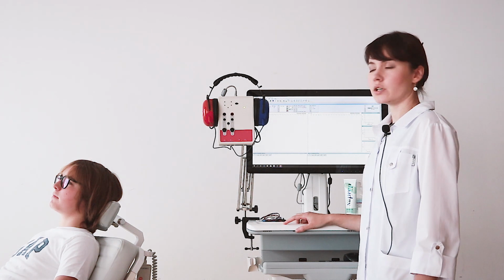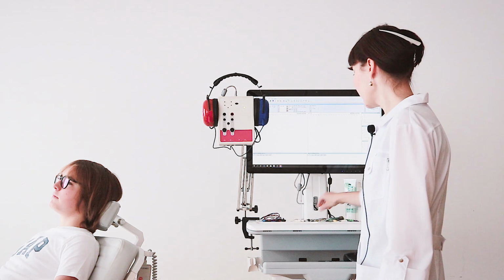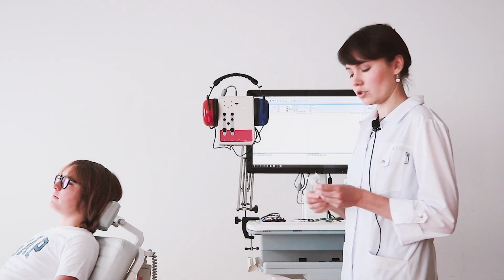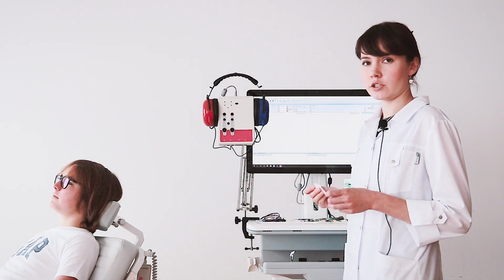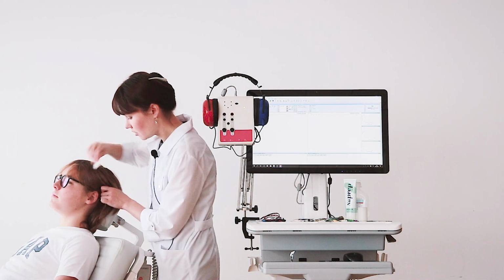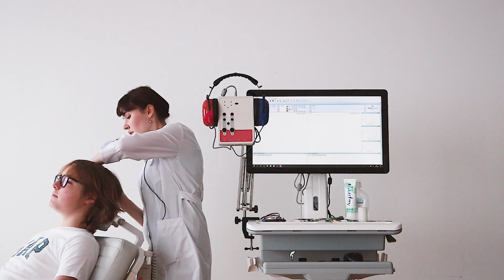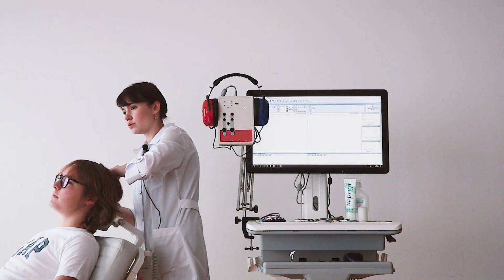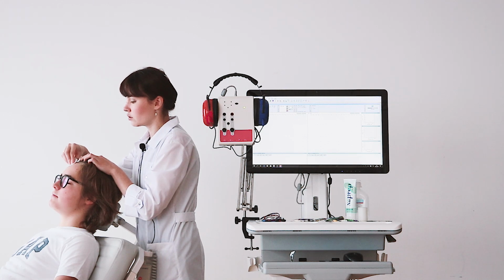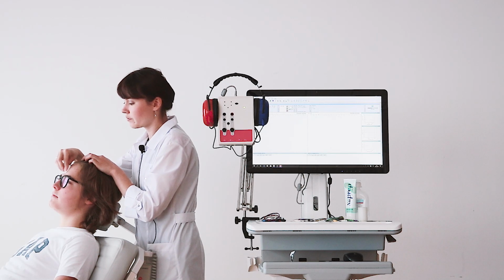We are ready to put on the electrodes. Before that, we need to prepare the patient's skin properly. Firstly, we need to degrease the electrode positions, especially if the skin of our patient is oily. We degrease the skin behind both mastoids, where we will put the active electrodes, and the skin on the forehead, on the high forehead and on the low forehead.